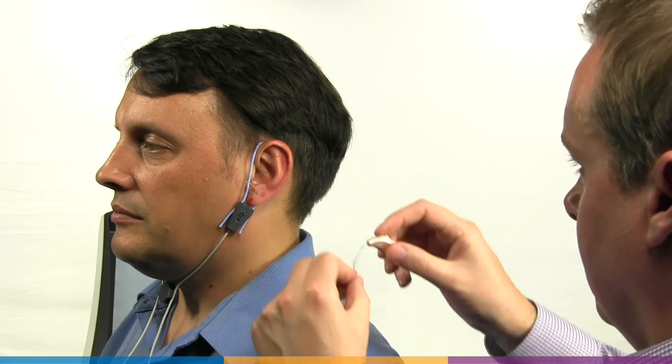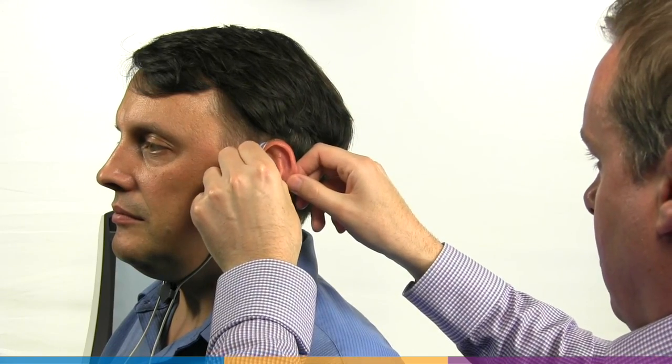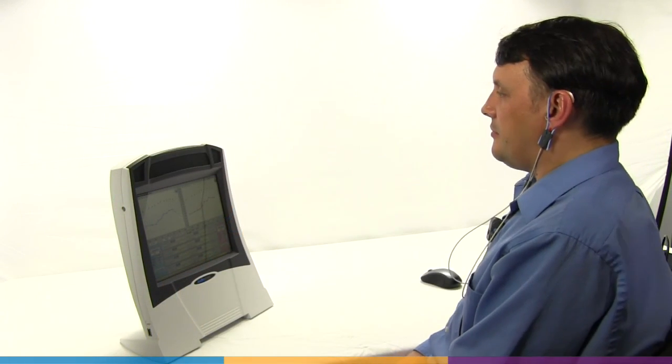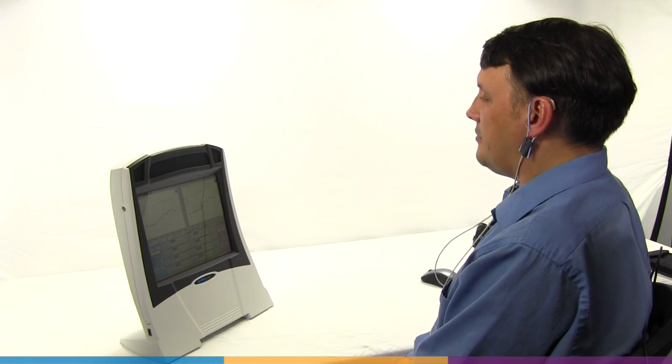Now insert the device. A dab of lubricant can be used on the outside of the device again to minimize slit leaks and ease insertion along the probe tube. Reposition the client and you are ready to begin testing.